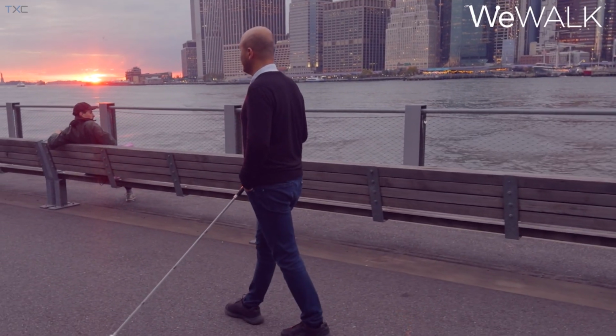That's fantastic. Can you speak to the user feedback and that of WeWalk's inventor, who is blind himself, and how that influenced the development of the 2.0 cane's design and functionality? Not only from the co-founder's personal experience, that's one part of it. They also work closely with the vision impaired community to get their feedback. Some of the feedback was to be able to detect above-the-ground obstacles, and also to make this more resistant to rain and different weather scenarios. Those are some of the feedbacks from working with the community and from their own personal experience, and that really prompted them to have this second generation design with many more sensors and more intelligence.